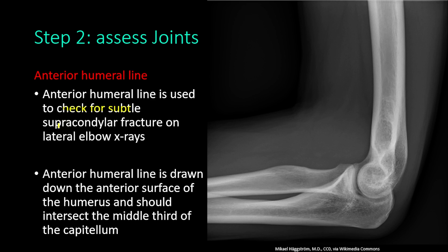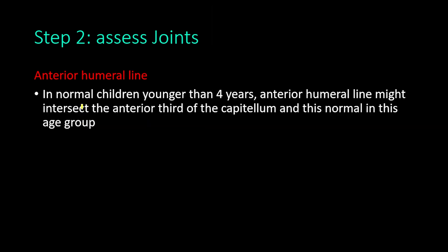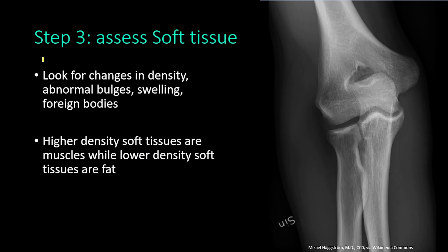The anterior humeral line is used to check for subtle supracondylar fractures on the lateral elbow x-ray. It is drawn down the anterior surface of the humerus and should intersect the middle third of the capitellum. This line is drawn only on the lateral view. In normal children younger than four years, it may intersect the anterior third of the capitellum, which is normal for that age group.